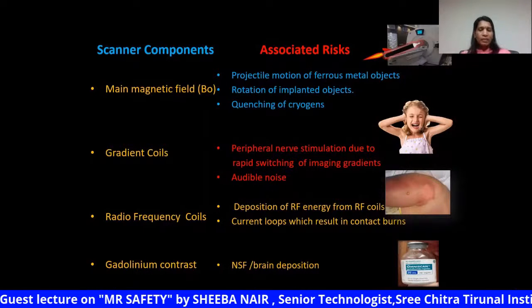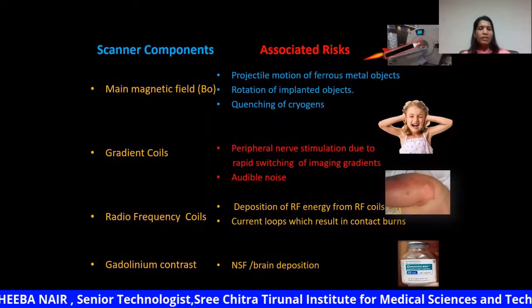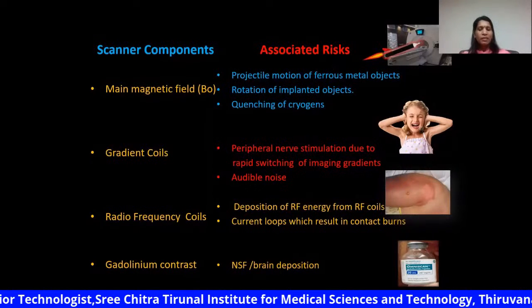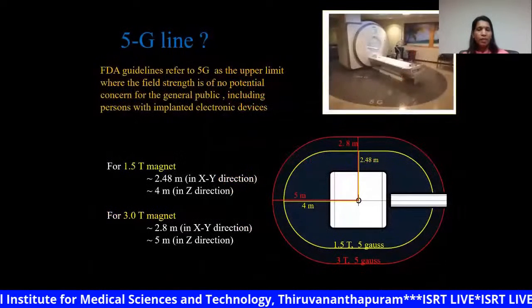With gadolinium, the safety concerns are nephrogenic systemic fibrosis and deposition of free gadolinium in the brain. So all these we will see separately.